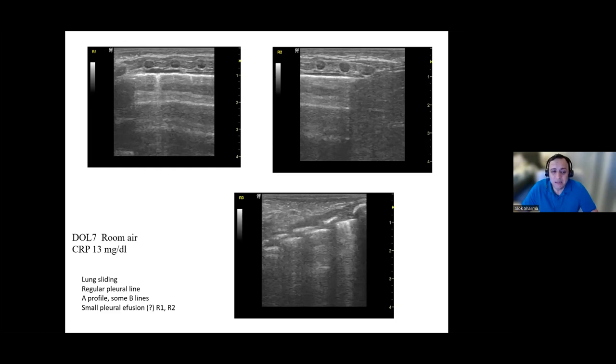It's actually on one side. So my overall feeling is you're probably dealing with either respiratory distress syndrome in a baby who's taking his time to get better, who may have met criteria for LISA. It doesn't bother me. I tend not to LISA big babies in my clinical practice. Some of them will smolder for longer, but they do need a good degree of sedation.